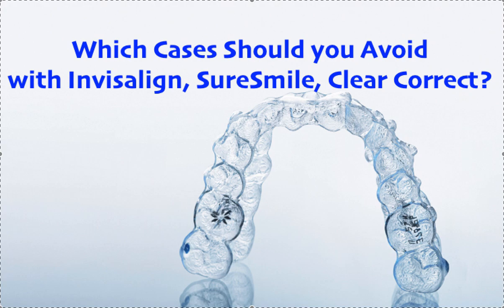And you have a CEF and CEF numbers. You don't even commit until that's done. Then you run this by an orthodontist who tells you if it's doable, if it's going to compromise their airway, if it's going to make things worse, if it's going to make them look better.